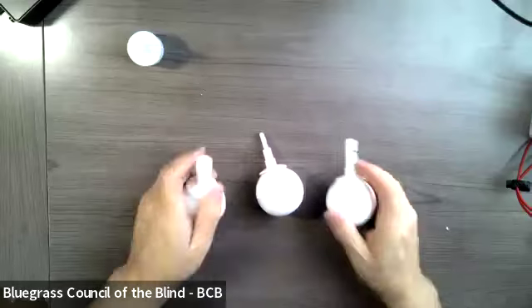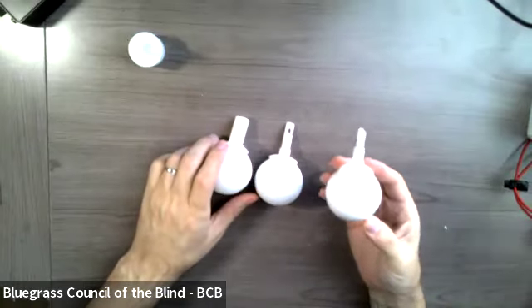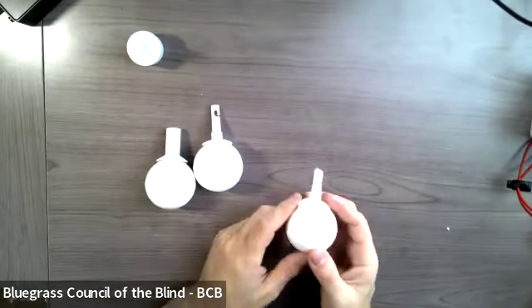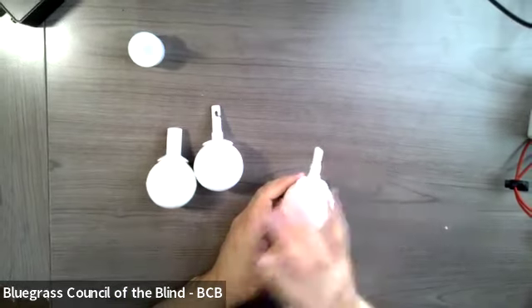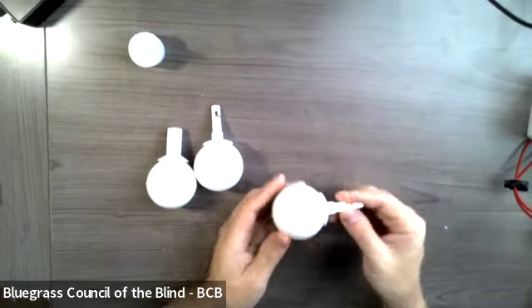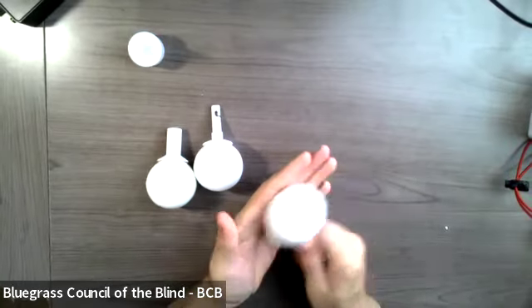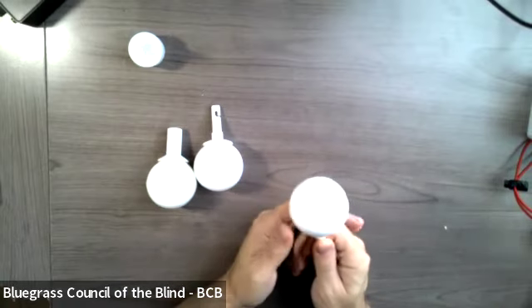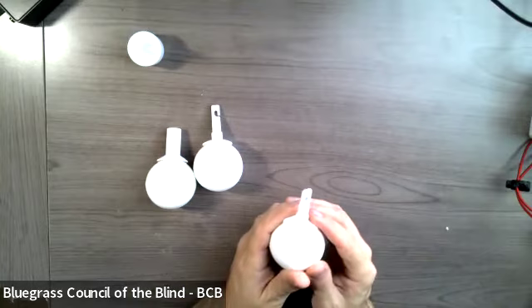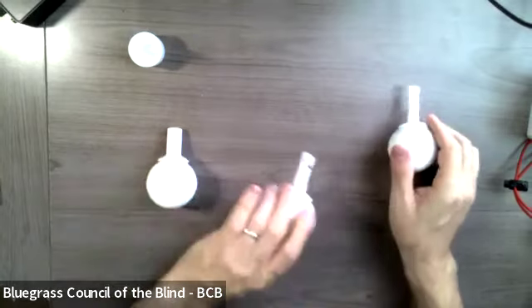Another fantastic tip that a lot of people really love is the large rolling ball tip. And I've got a couple examples of that tip here, but they're all different types. They're all rolling ball tips, but they're slightly different. So it's about the size of a tennis ball, and it rolls side to side just like the marshmallow one does. And this particular one that I have here is a hook style tip. So this would go on a hook style cane.